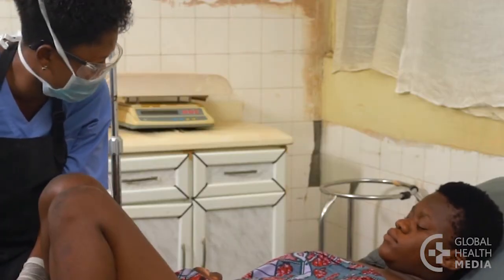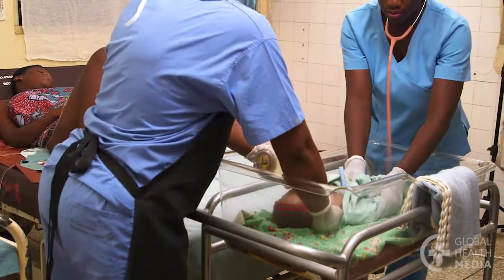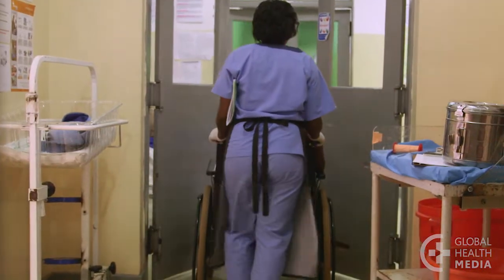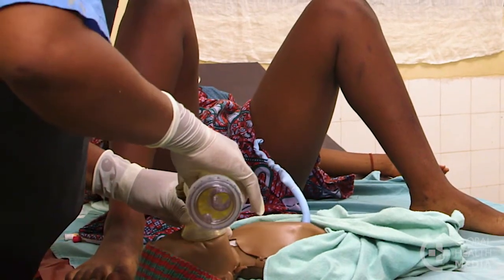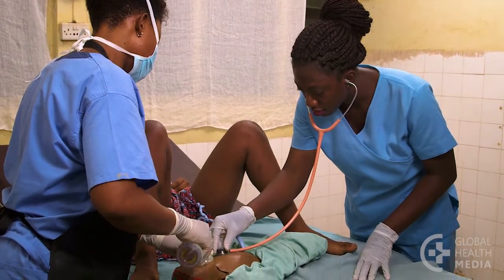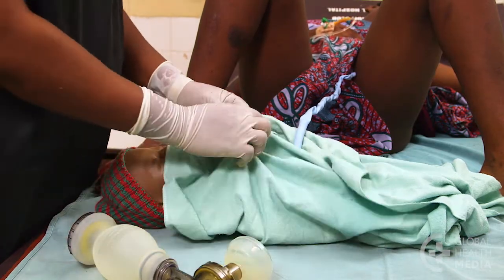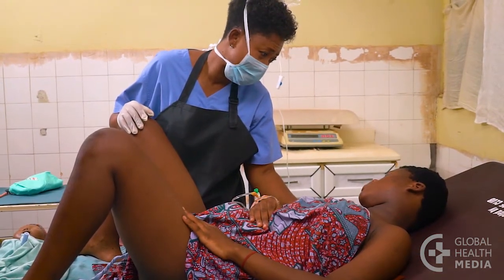Discuss the situation with the mother and family. If referral is possible, continue giving breaths to the baby and keep her warm during transport; transfer the mother with the baby. Sometimes a baby will not survive even when you give breaths with a bag and mask. If there was no heartbeat at birth and you cannot detect a heartbeat with a stethoscope after 10 minutes of giving breaths, stop your efforts to resuscitate. Gently explain to the mother that the baby has died and give her supportive care.